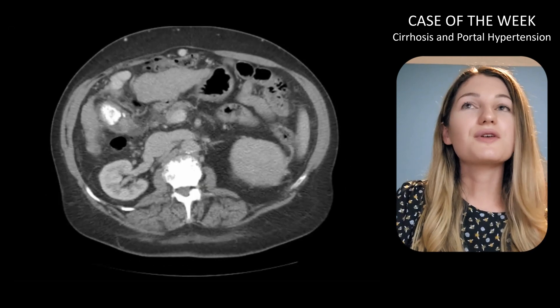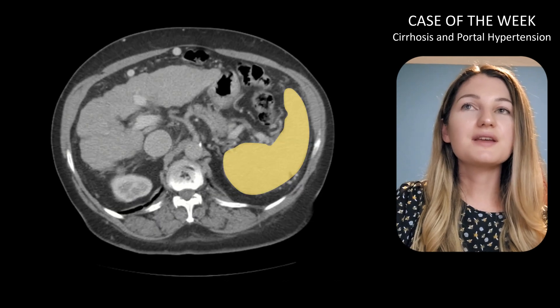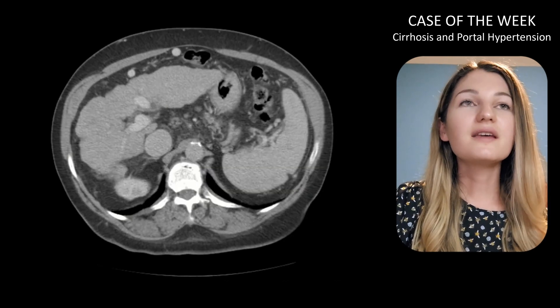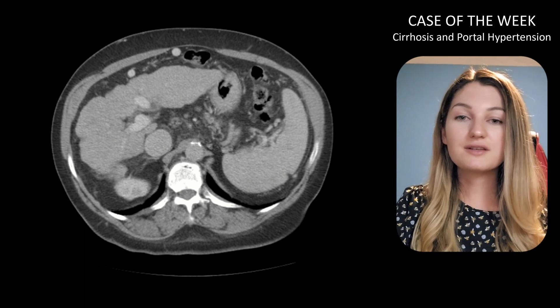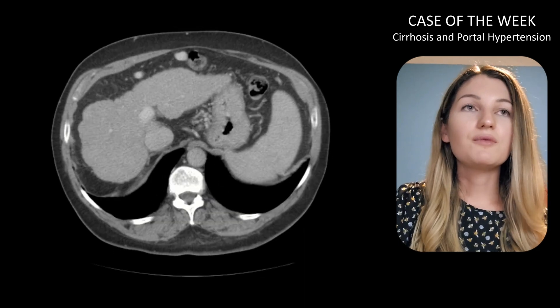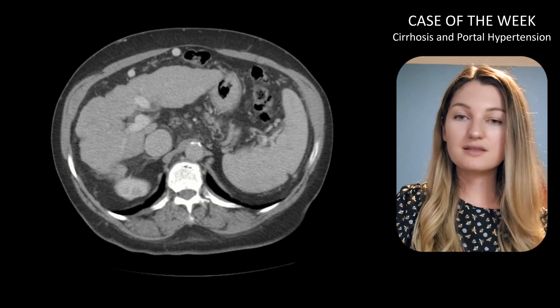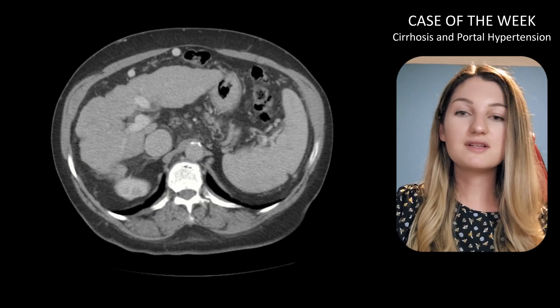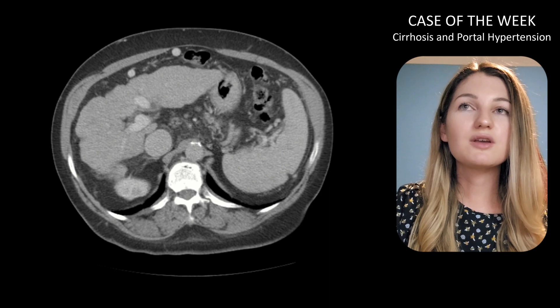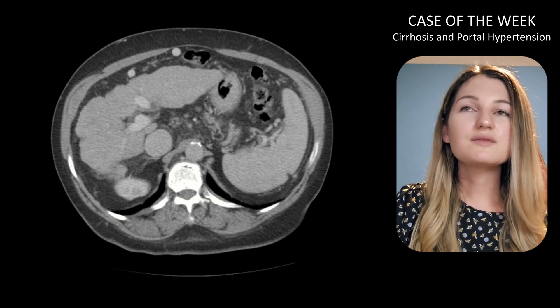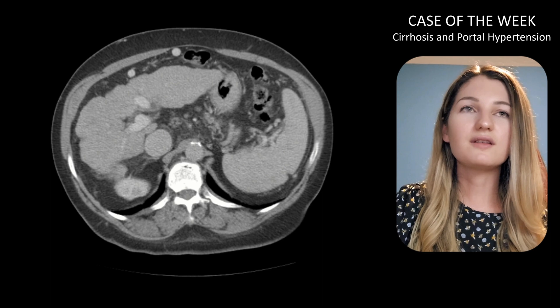Scrolling back up, let's take a look at the spleen — this spleen is definitely enlarged. Unlike the liver, which you measure at the mid-clavicular line, you can measure the spleen in any dimension. We want our spleen to be around 12 centimeters, and we definitely don't want it to be over 14 centimeters. This one measured 14.5 centimeters, so it is definitely enlarged.